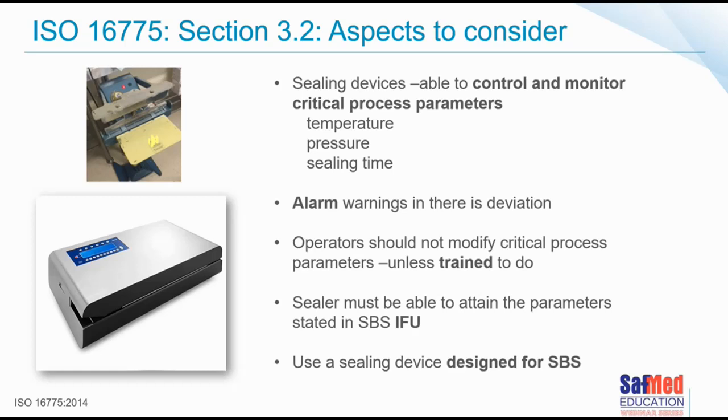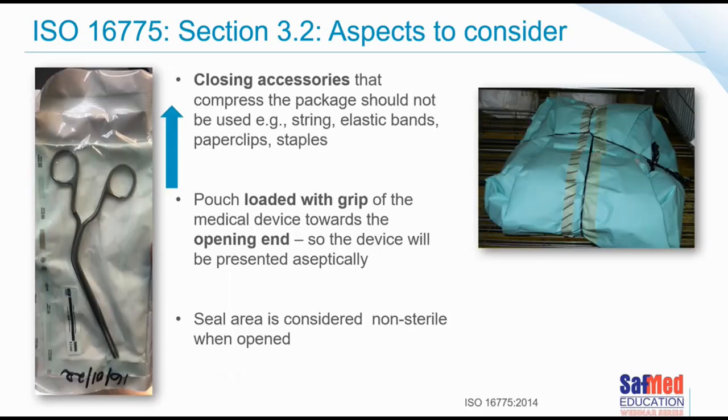Use a sealing device that is designed for sterile barrier systems, not one designed for arts and crafts or food parcels. Please, we need the correct type of heat sealing device. Closing accessories that compress packaging should not be used, like elastic bands, paper clips, staples, or string.